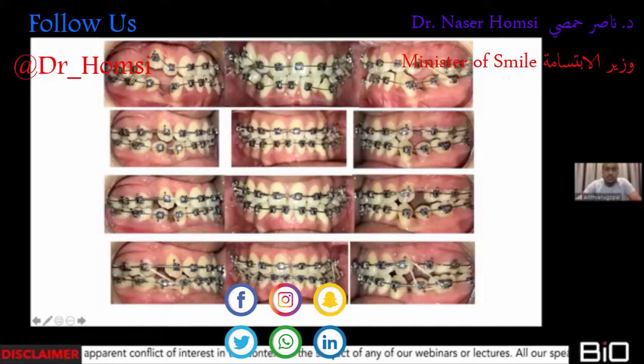So as you can see over here, in any particular case, I would use the same. I've bypassed the teeth that were very difficult to engage. I've used an 016 or 014 thermal niti. I use early elastics not only in self-ligating, but I use them in conventional brackets as well. And this is just in order to get the canines down. Ideally, I would not have engaged this canine. I may have just bypassed this canine and so on.